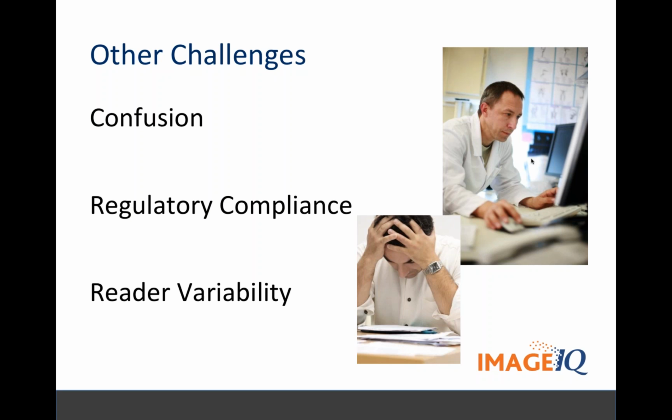Right, and if you run some of these trials, you may not even know you have these compliance issues. So in general, a radiologist will use whatever they're comfortable with in terms of making these measurements for the different criteria. So they probably are going to use something that's attached to their PACS system, or they're downloading some software like Osiris and they're making their measurements. But as they make these measurements, they're not being audited, so they'll draw along the long axis of a tumor, but nothing's really being saved, right? You could actually force the save. You can save an overlay or an annotated image, but that's not really tied back to the original case.